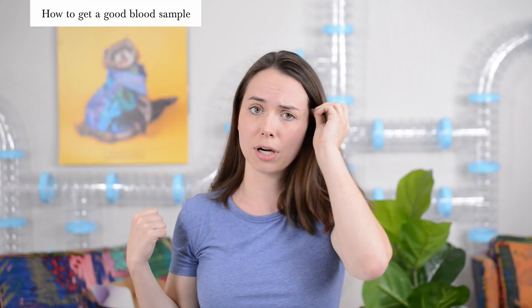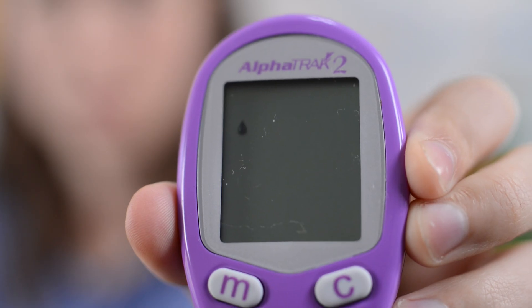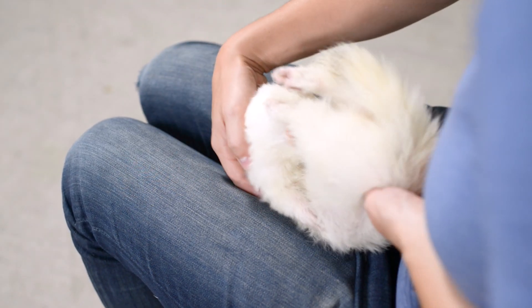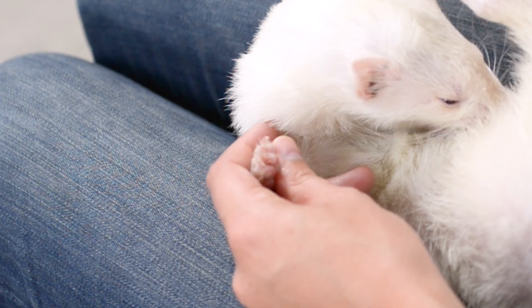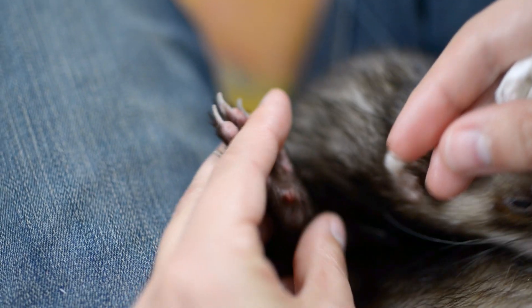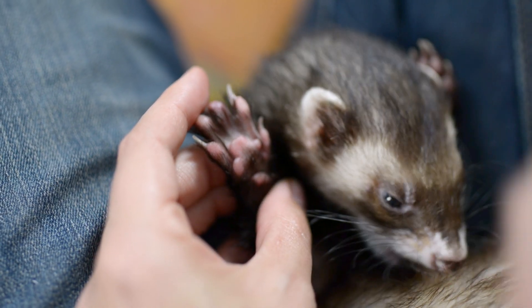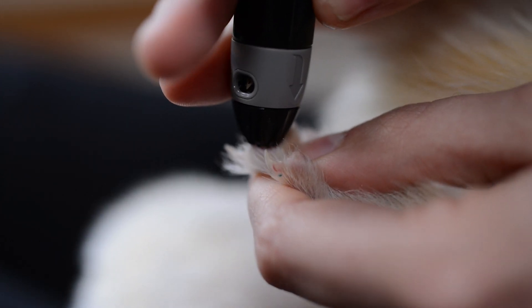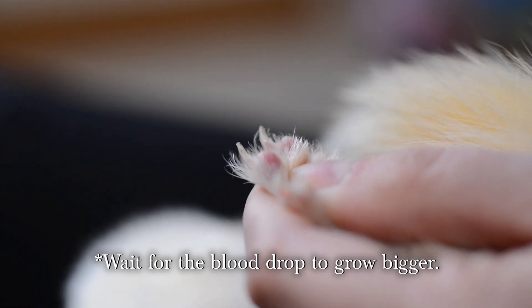Now grab the blood glucose monitor and push the test strip the rest of the way in. When it's ready, it will start blinking and show a blood symbol in the little strip window, which means it's ready to take a sample. If you're right-handed, grab their paw with your left hand, then use your thumb and fingers to grasp the arm just above the elbow. Use your pointer finger to pull back the nails and stretch open the paw. Place the lancing device on their little toe bean, already cocked back and ready to prick, then click it.